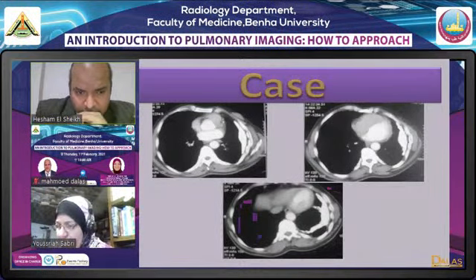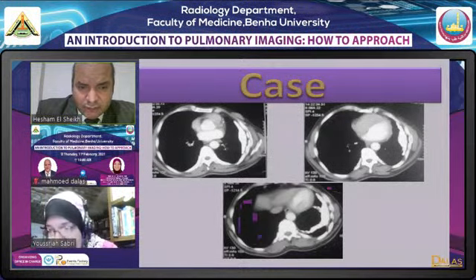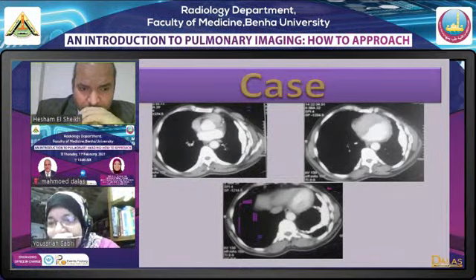Another question, Dr. Youssriah, how to differentiate cicatricial fibrosis from honeycombing.